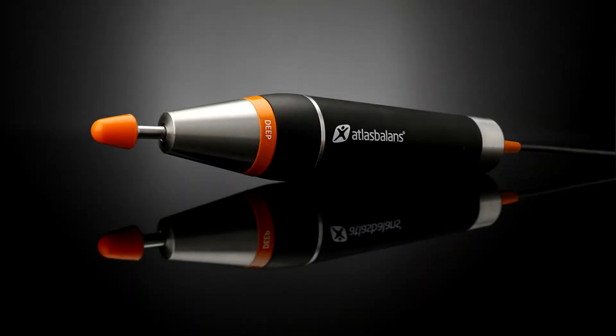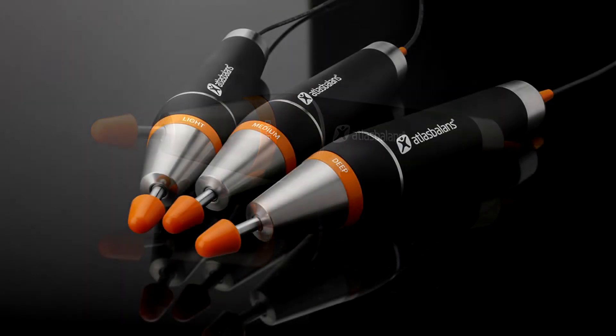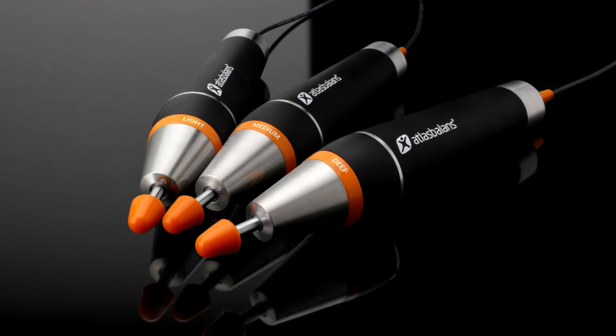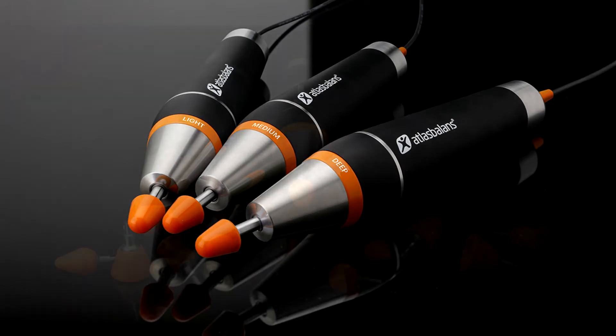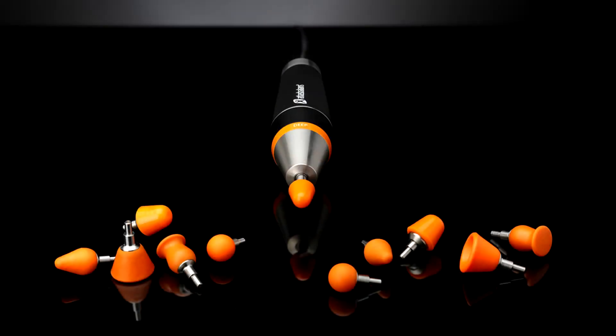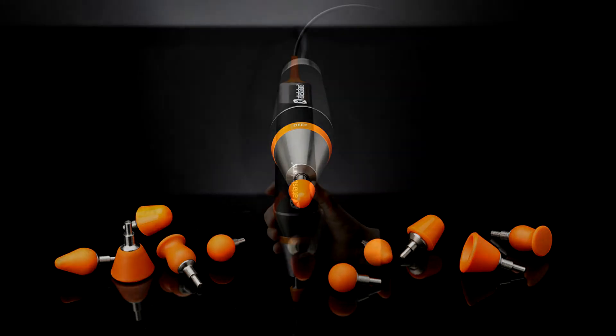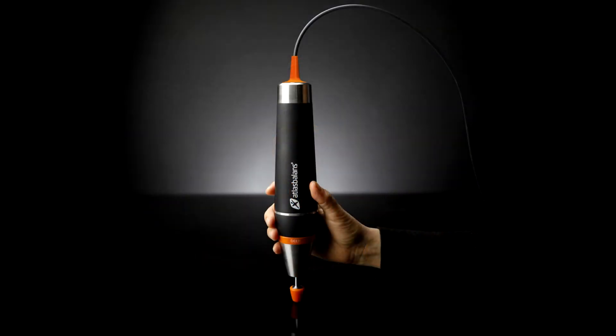The machine uses a powerful high-tech electrical engine encapsulated in a single piece of crafted aluminum which reduces sound and gives the machine a comfortable weight. This makes treatment less physically demanding for the therapist.